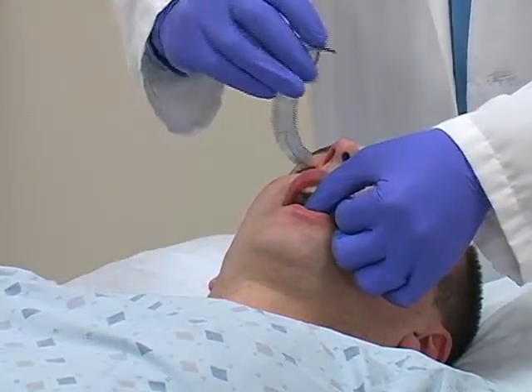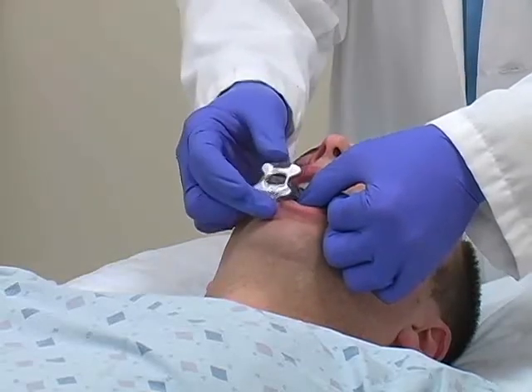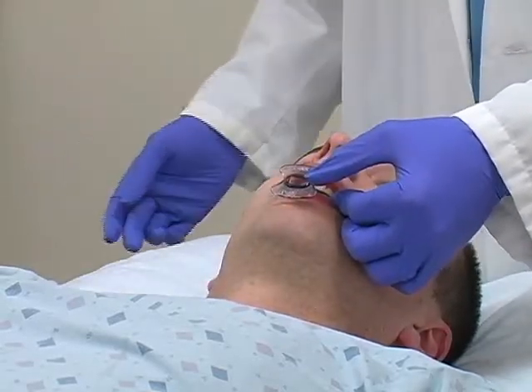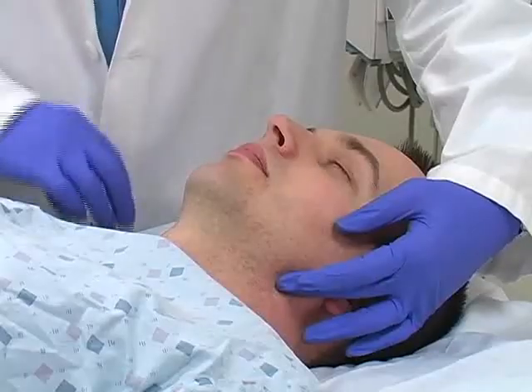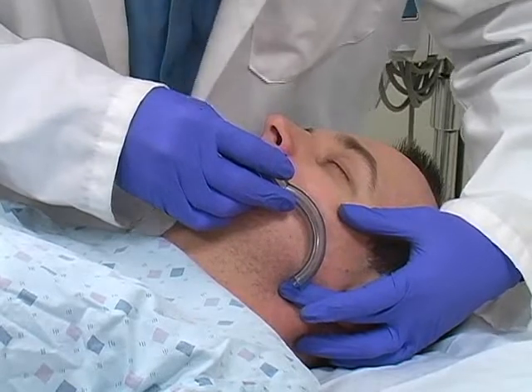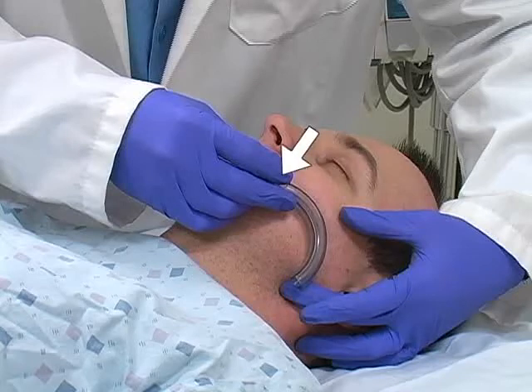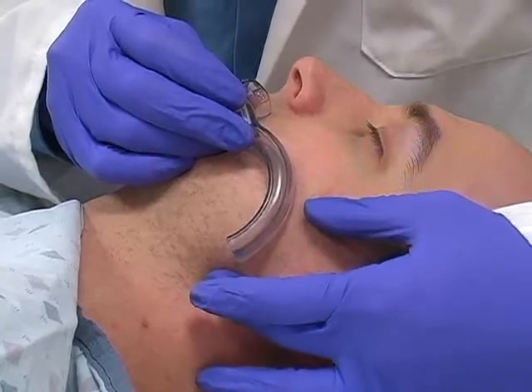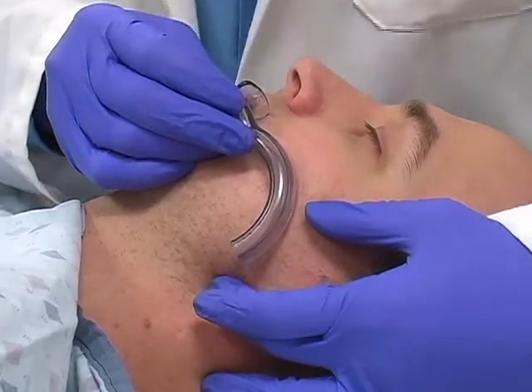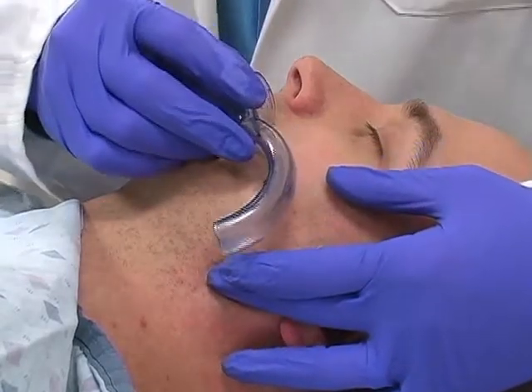Oropharyngeal airways are used to maintain airway patency and generally should be used whenever bag mask ventilation is required. First, determine the appropriate size oropharyngeal airway for the patient. When held against the side of the face, a correctly sized airway will extend from the lips to the angle of the mandible. This airway is too small since it does not fully reach the mandible and should be replaced with a larger device as shown here.